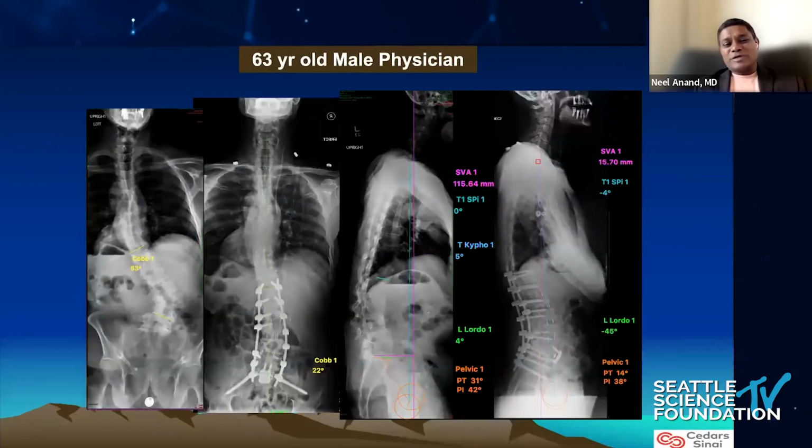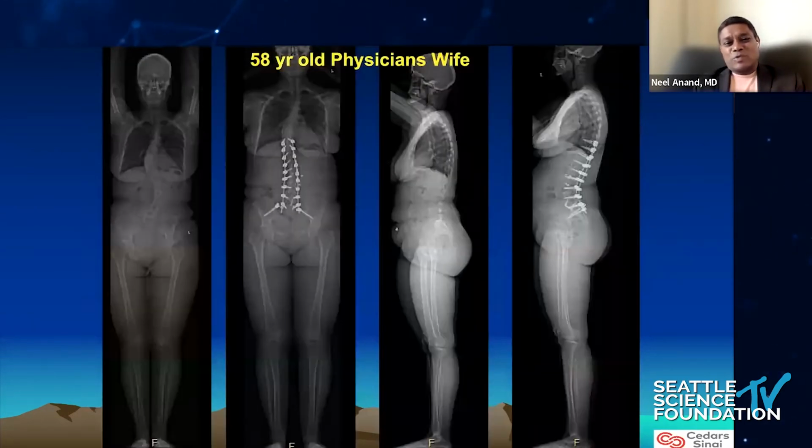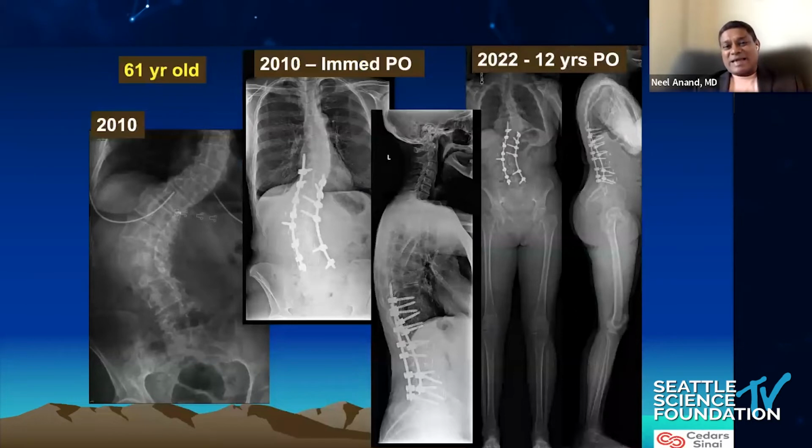Here's another patient. We can consistently show the same pattern. Here's thoracolumbar kyphosis corrected without a single osteotomy with this protocol we talked about, going lateral and lining them up, screws and rods. There's another physician's wife, same thing, thoracic curve left alone, realigned, corrected. All these people are doing extremely well. This is a 12-year follow-up on something started way back. Pure thoracolumbar, left the rod long enough. She never needed it. She came to me now for cervical spine, by the way.